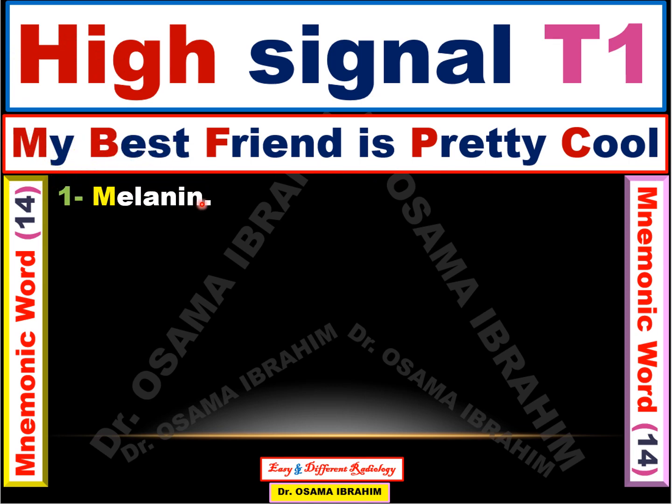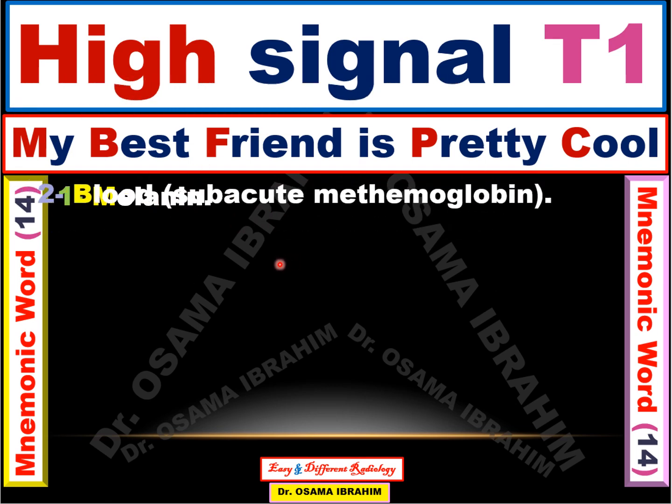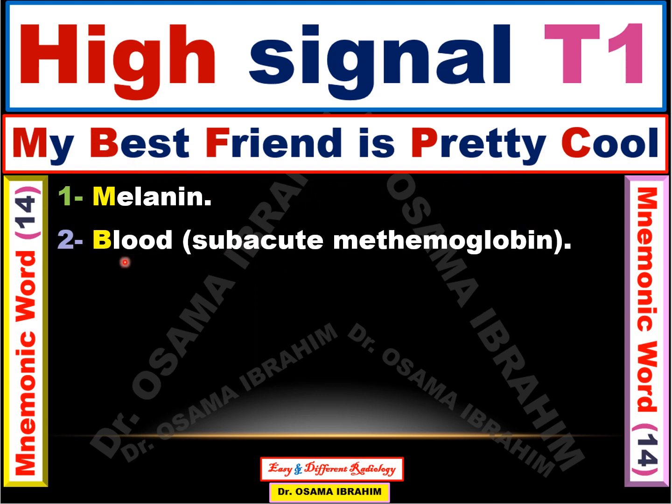M is from melanin, like melanoma metastasis from a primary at any place of the body, and if the lesions are multiple and metastatic and you have a known primary, melanin can be considered a cause of high signal in T1. B is from blood in the subacute phase, methemoglobin, because blood can appear in acute, hyperacute, subacute, early and late subacute, and also chronic phases. In the subacute phase, early or late, it appears high signal in T1.